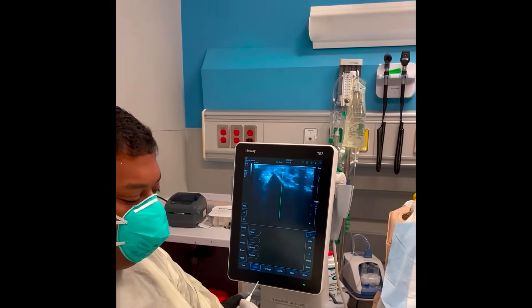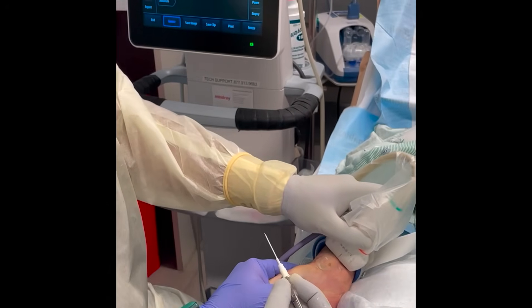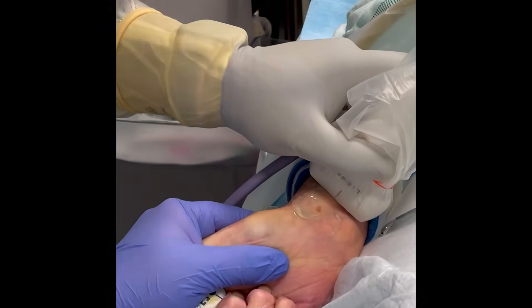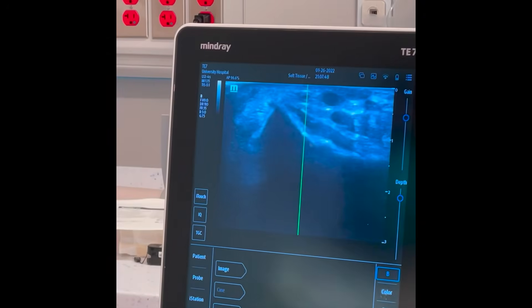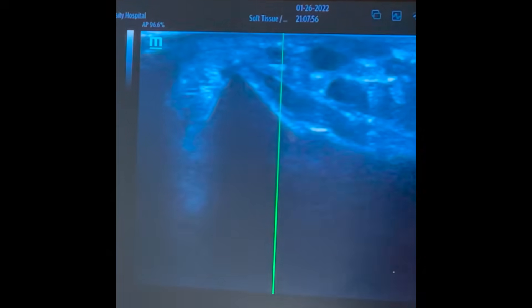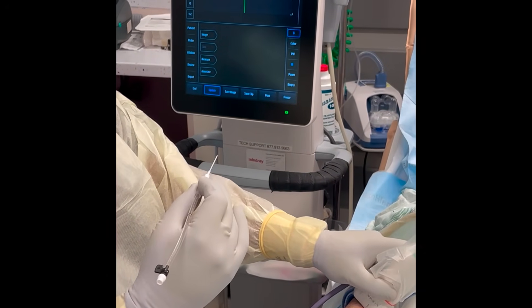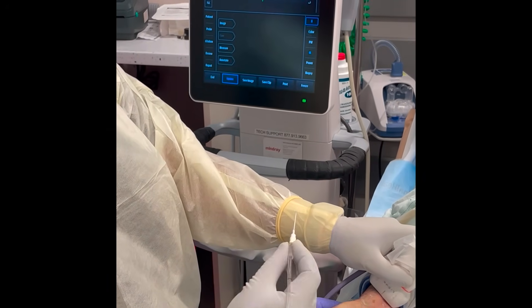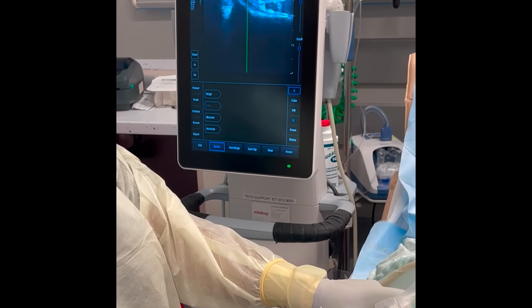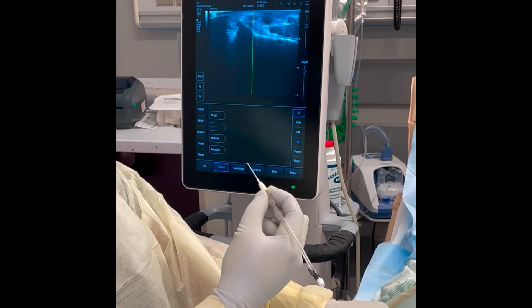Once we've found our vessel, we want to take the needle with the bevel up, and insert it about five millimeters to one centimeter in front of your probe — so that when you enter the vessel with the needle tip, that's going to be where the probe is looking. If you go right where your probe is, you'll be past your probe when your needle tip is near the vessel. Based on this, we can see it's less than half a centimeter below the skin surface, so it's not very deep at all.